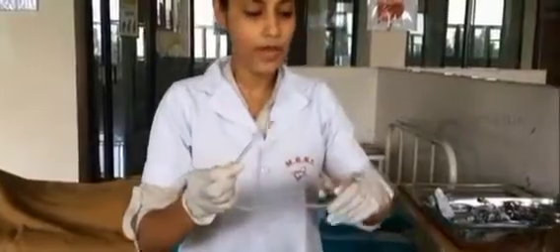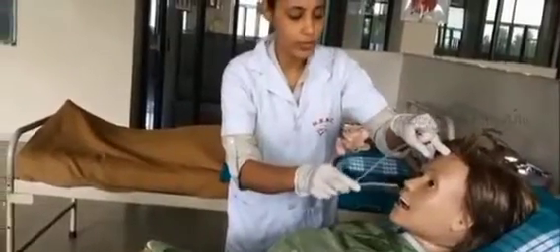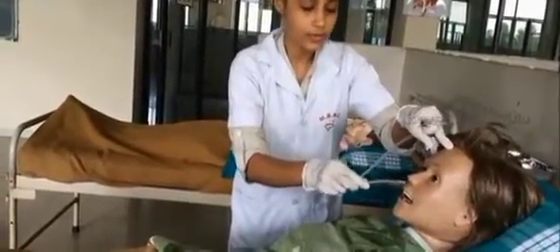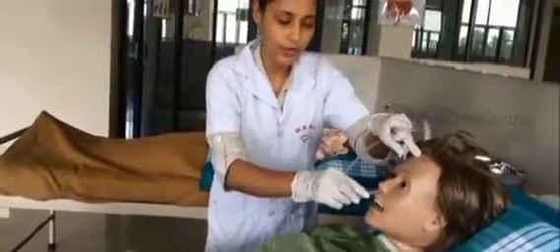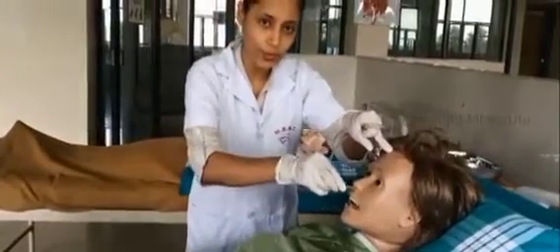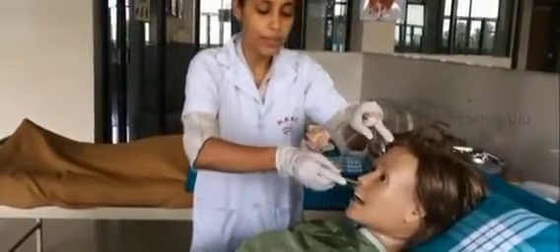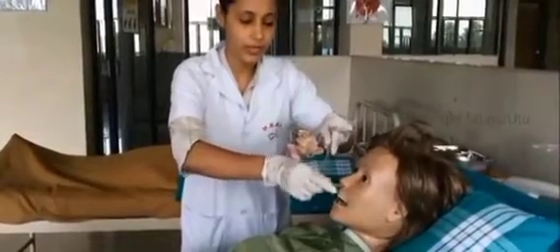After lubricating, we have to insert into the patient's nose. If the patient is conscious, we have to tell the patient that while introducing there will be some discomfort, and before introducing, tell the patient to swallow for easy insertion. So we have to lubricate and slowly but as quickly as possible introduce it, because sometimes there is a chance of the patient not feeling well.